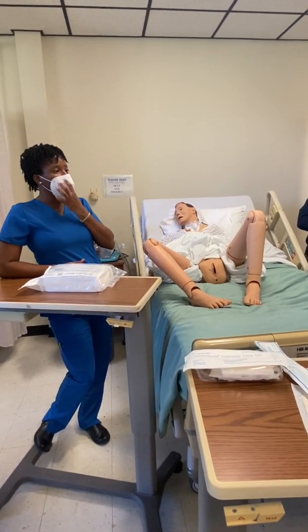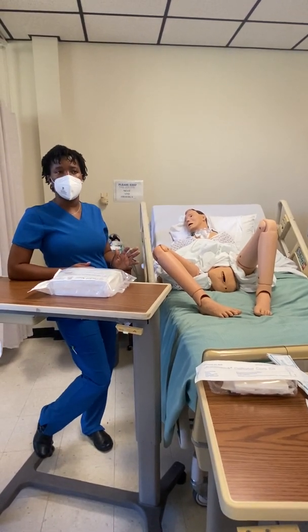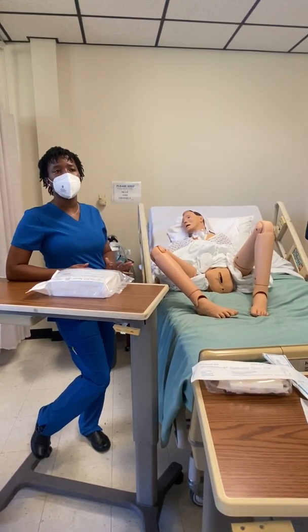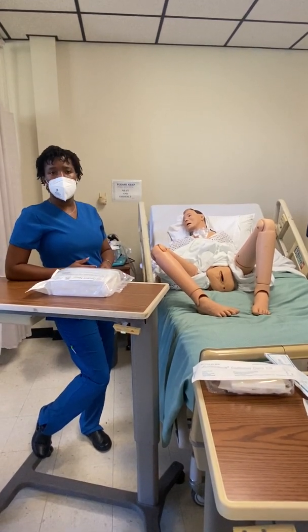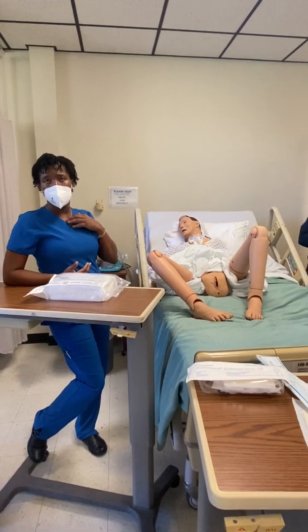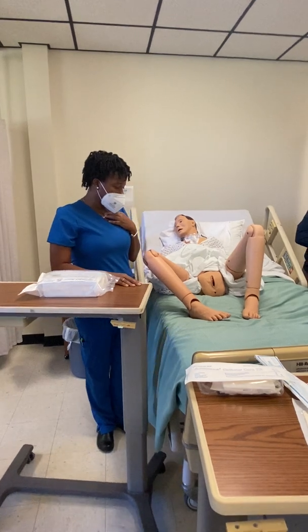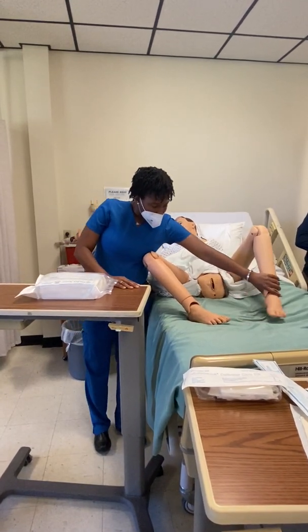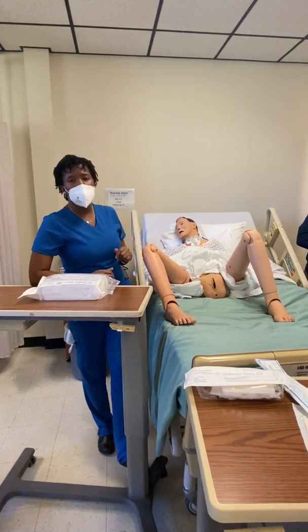And when you look at your handbook, you're gonna see that some steps you just want to get over with when you first go in there. You don't have to worry about remembering to do those anymore, okay? So that's one thing. We want to make sure that perineal area is clean because we don't want to introduce any more bacteria in there. Any bacteria, actually. Okay? So that area is clean, and we got a good opening. I try to spread the legs further apart because I'm going to move my catheter there.